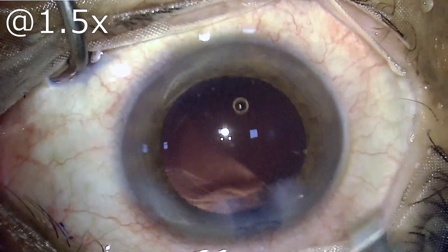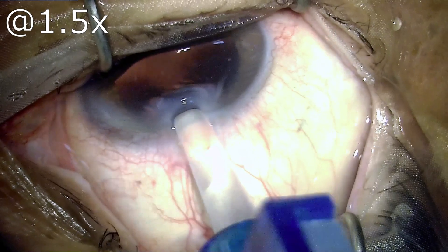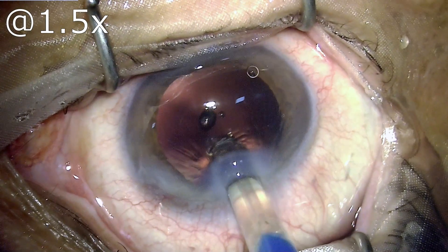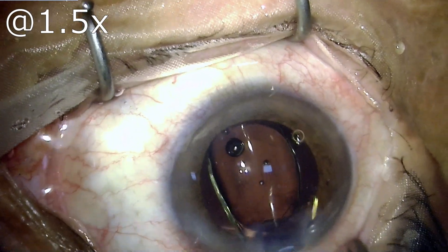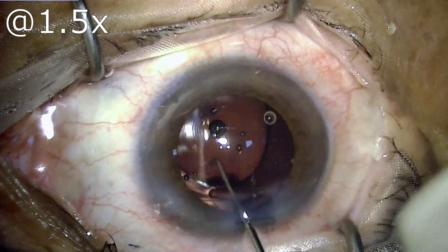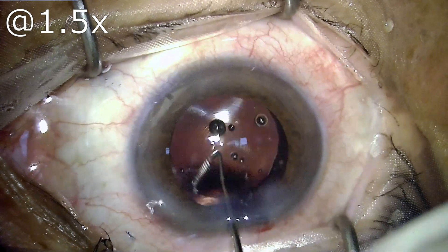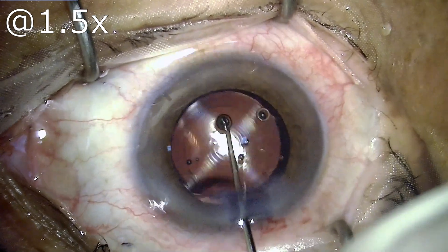Once the capsule has been cleared, it is time to implant the IOL. In this patient we had selected a hydrophobic multifocal IOL — as you can see the markings on the lens itself. This lens is going to provide clear vision for all distances, near and far. However, the deficiency I see is that the capsulorhexis is not of adequate size and is covering a large part of the optic.